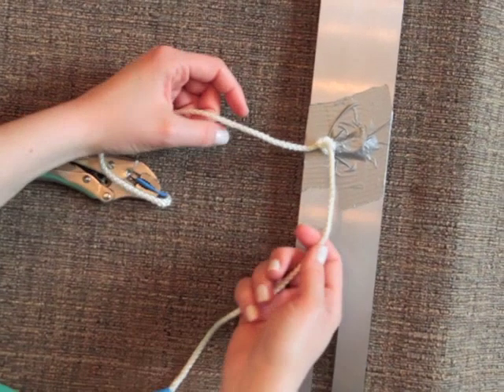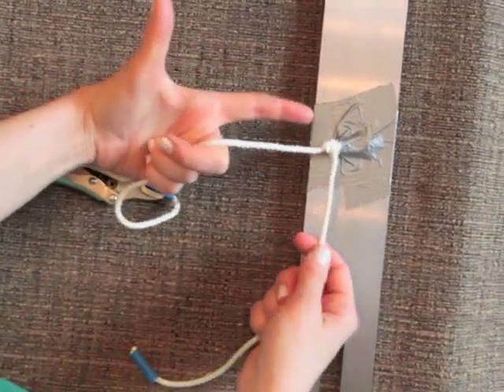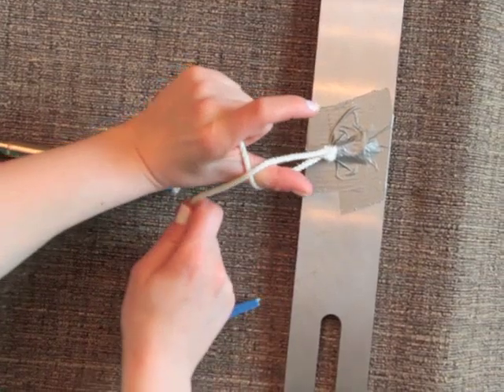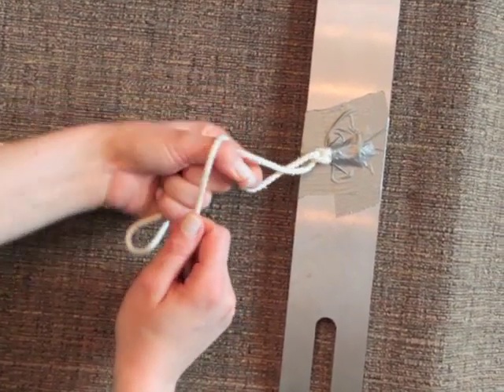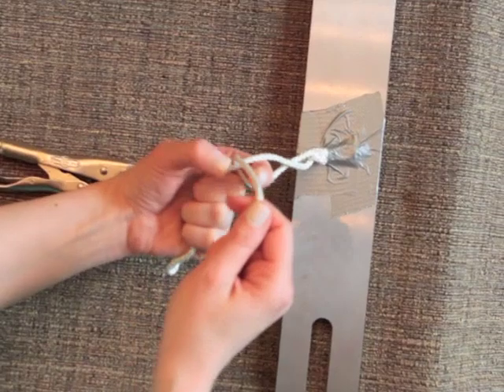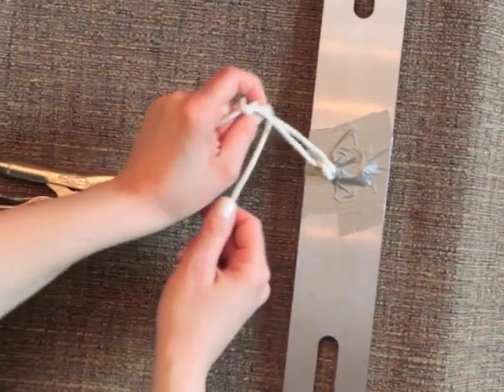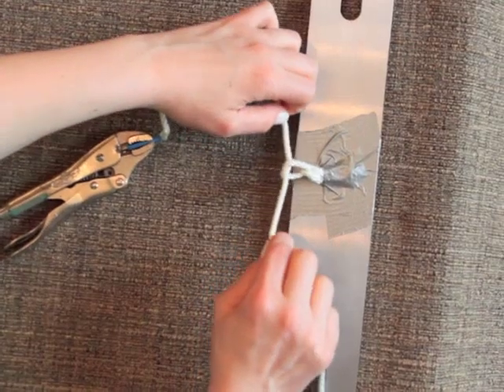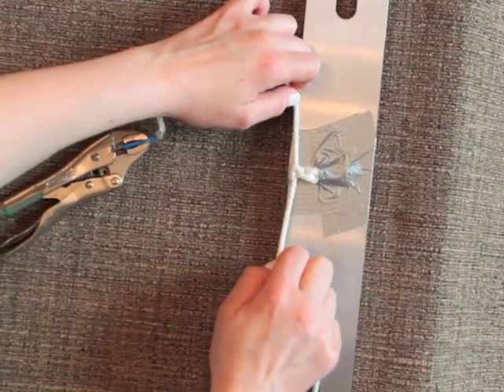So let's try it again. Gun hand. C. Thumb. Make an X. Pinch. Put your tips to the sky. Replace back through to the sky and pull through. And really follow that knot down to the base so it's secure.